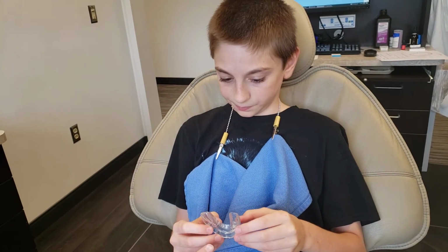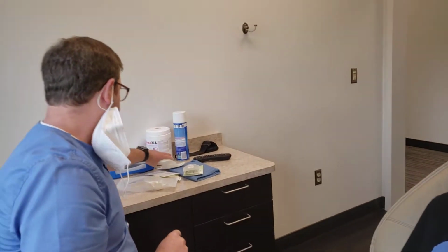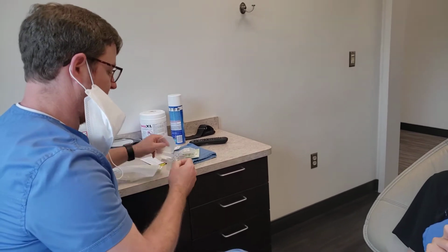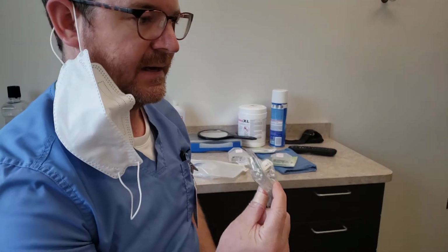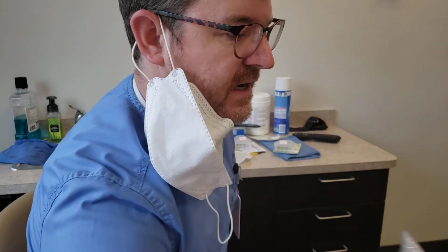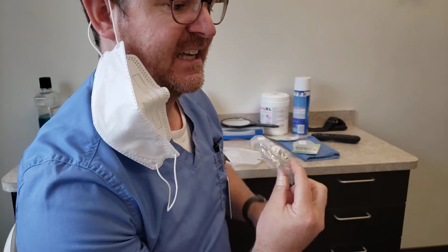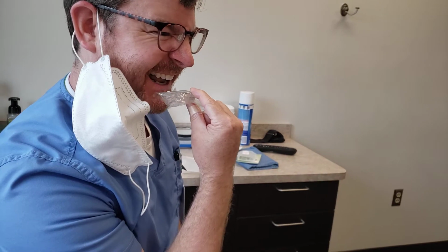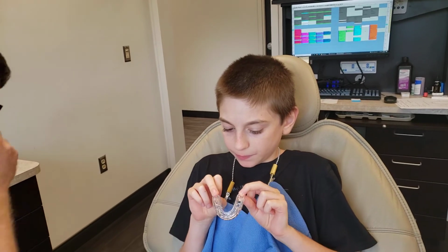So whenever you're putting that in, what some people find works well... I'm not gonna put this in my mouth, but it's still in the bag. If you put your finger right in that little heart-shaped part, and then when you put it in, use your finger to kind of guide it right to the center of your two front teeth. So when you're putting it in, you kind of hold it like this, and then you try to touch between your two front teeth. And I'm going to put some gloves on to show you what I'm talking about.